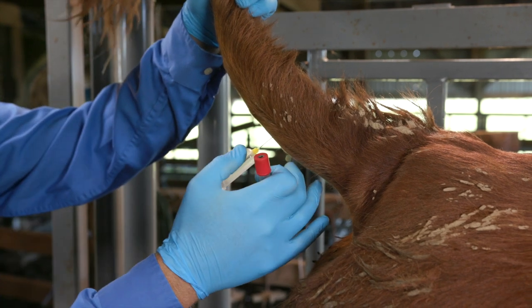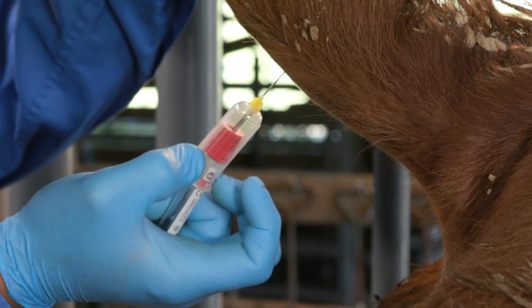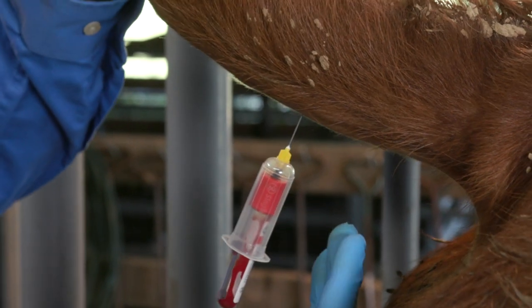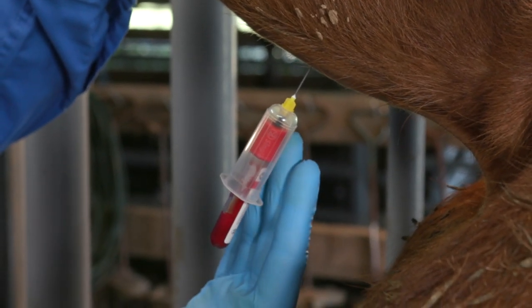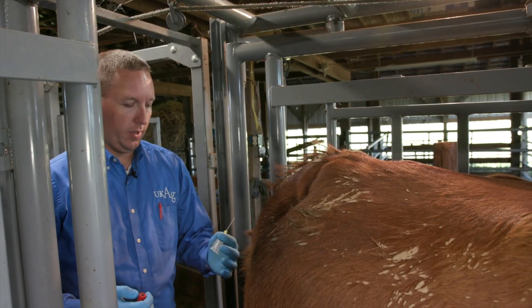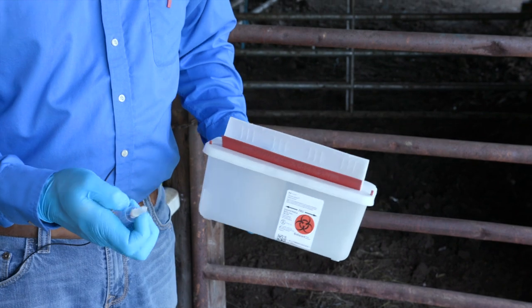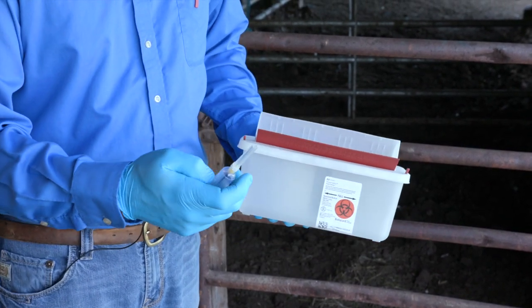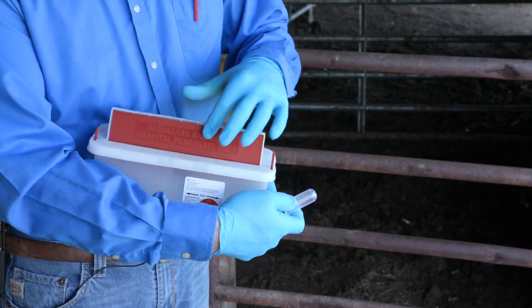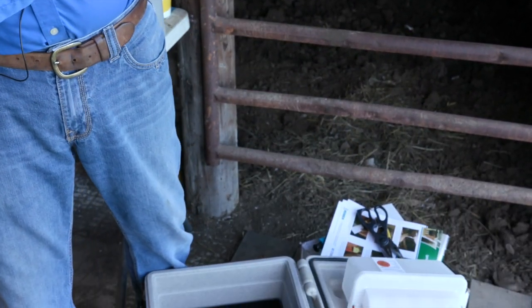When we reach a stopping point with the needle, we can pull back slightly and we'll be close to the vein. If we're in the vein, the blood should start to flow — and we can see it flowing now. There it is. We then apply the vacuum tube through the holder to collect the sample, and afterward dispose of the used needle into the sharps container for proper disposal.